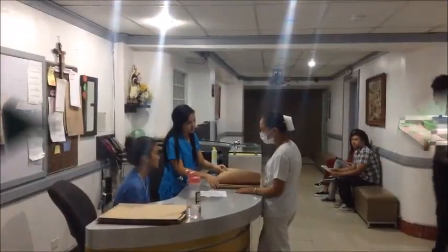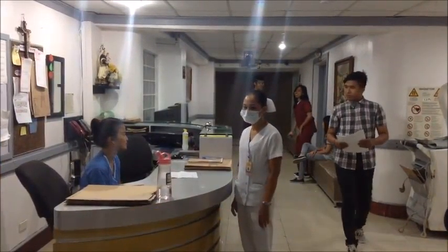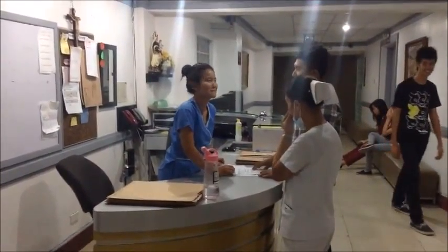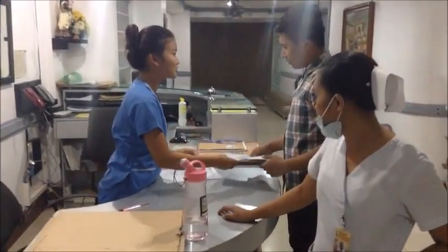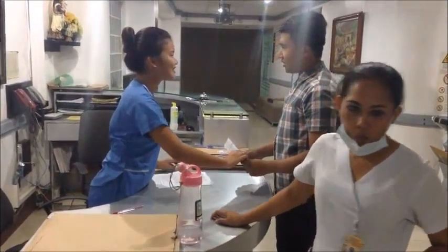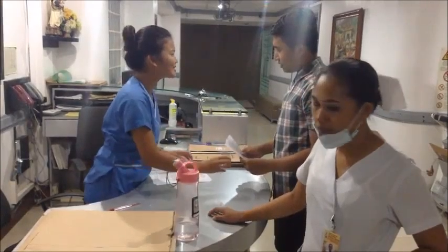When you arrive, our counselor will greet you and make sure you have all your information and answer any basic questions. In preparation for a CT scan, patients are often asked to avoid food, especially when contrast material is to be used. Contrast material may be injected intravenously or administered by mouth or by an enema in order to increase the distinction between various organs or areas of the body. Therefore, fluids and food may be restricted for several hours prior to the examination.